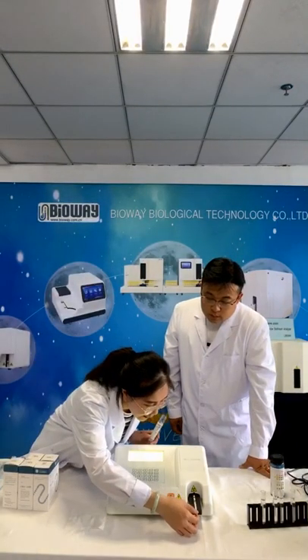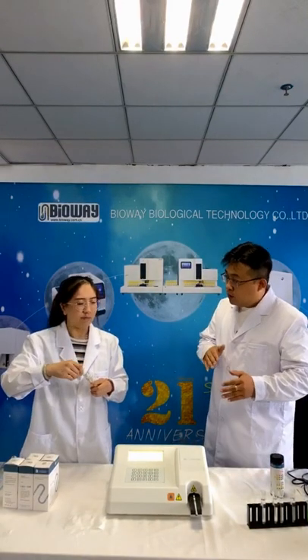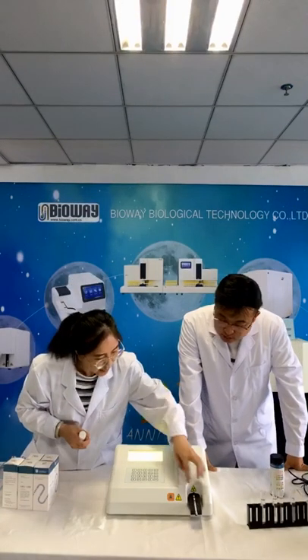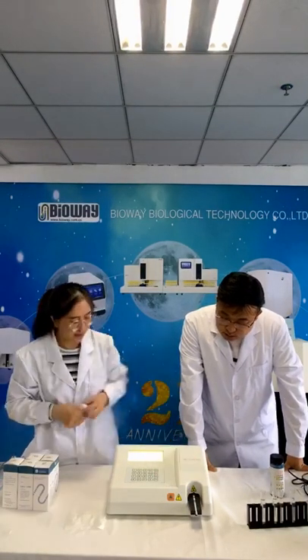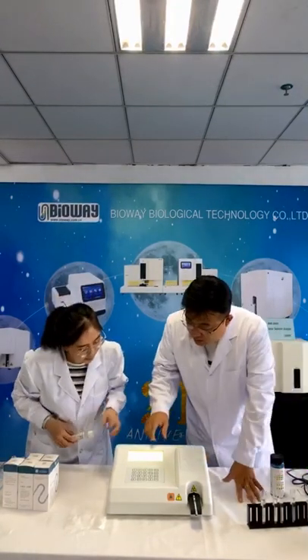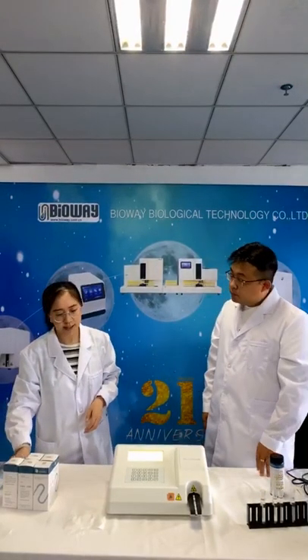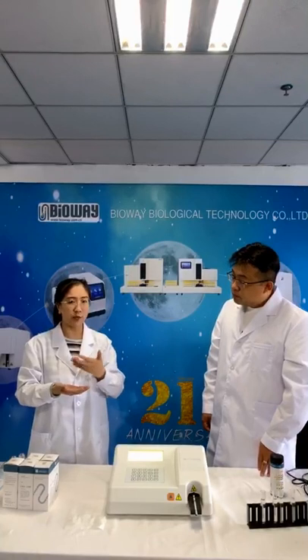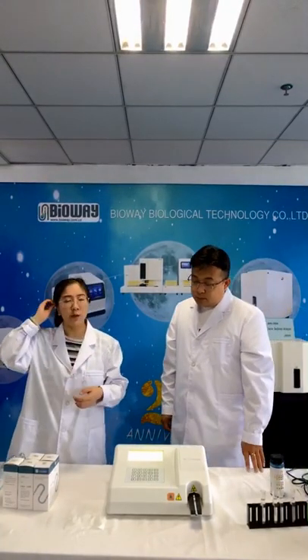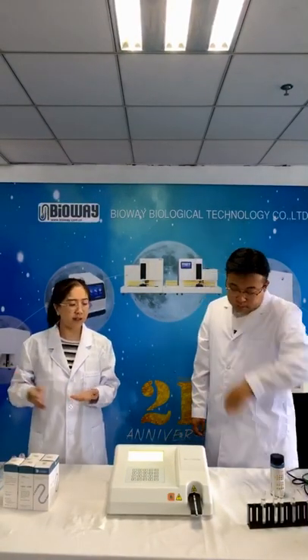You put it here. Oh, this one is not continuously fed into the machine? Actually, it has two modes. I will show you later. Put it here and click start. You need to wait about 30 seconds here. Just as Justin said, the strip needs some reaction time. Oh, yeah, 60 seconds for the first sample, so it takes longer. And for the second and third, it will be faster.